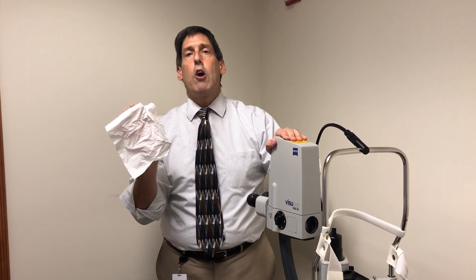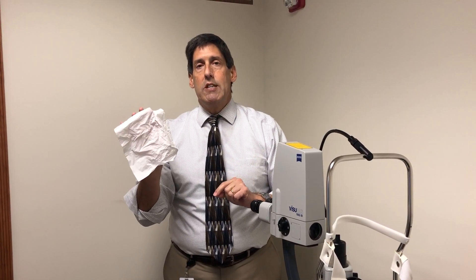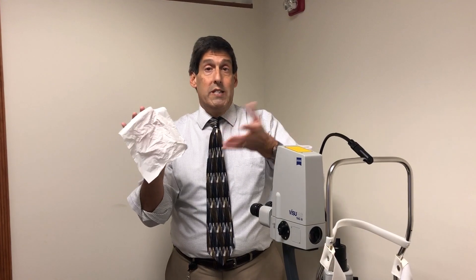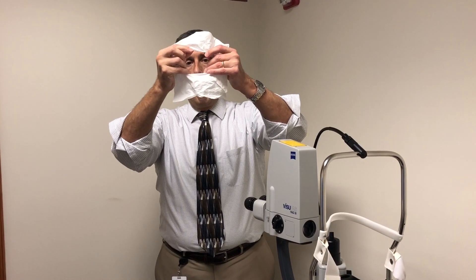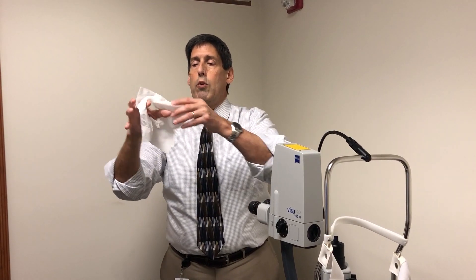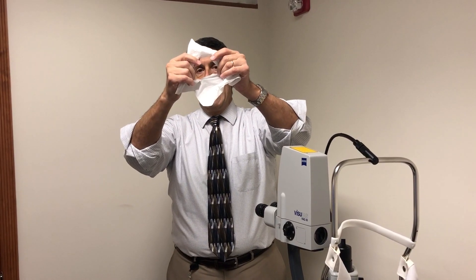There's a very simple solution, and that solution is right here in front of me — it's called a YAG laser. With the YAG laser, the patient sits, puts their chin in the chin rest, and looks straight ahead. The procedure is painless — no preoperative clearance, no shots; we just put in eye drops to dilate. What the laser does is make a nice, clear opening in the center of the posterior capsule, so the light rays go through the eye, through the lens implant, through this nice clear opening, and vision is almost instantaneously much more crisp, sharp, and clear.